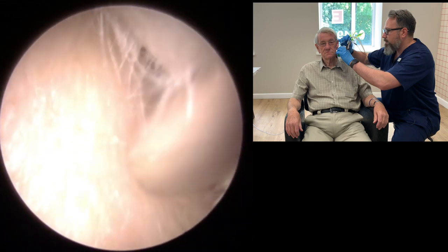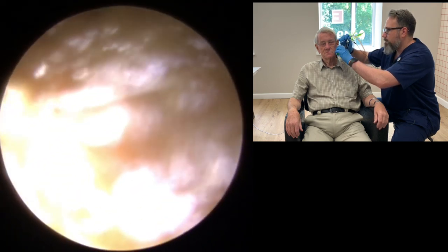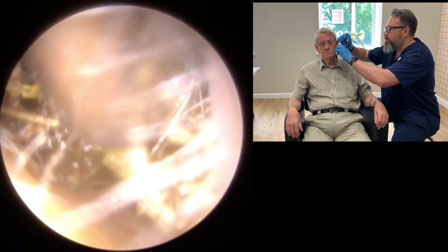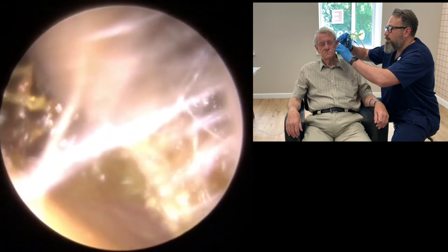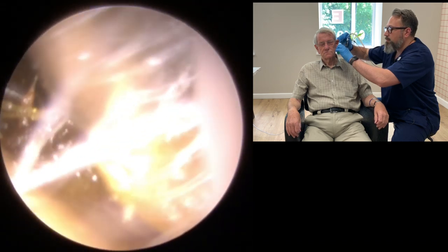Start everything up. Okay, so here we go. Let's turn this light on. So we're just going to pop the camera in first of all. Just using the standard size on the tube here, we're going to prop the canal wall open a little bit. So you can see a very soft golden colour wax here at the entrance to the canal. So we'll just start suctioning this away first of all. You can see it's starting to come away from the canal wall, so just trying to unstick it from this entrance at the beginning.